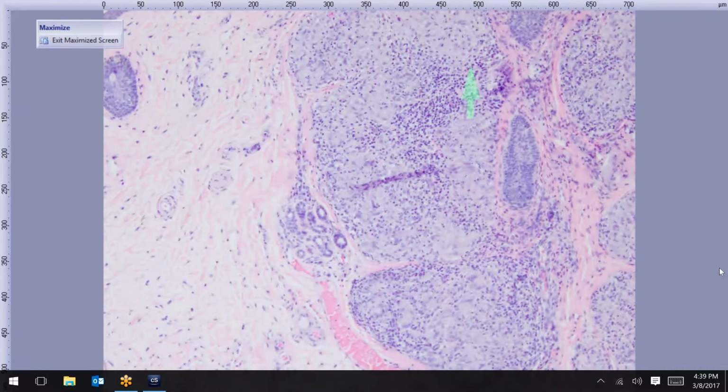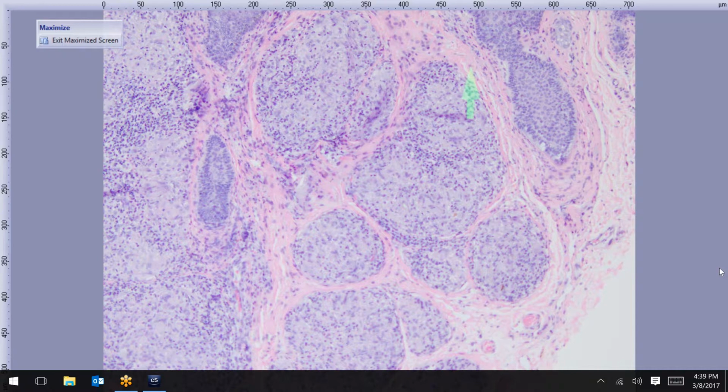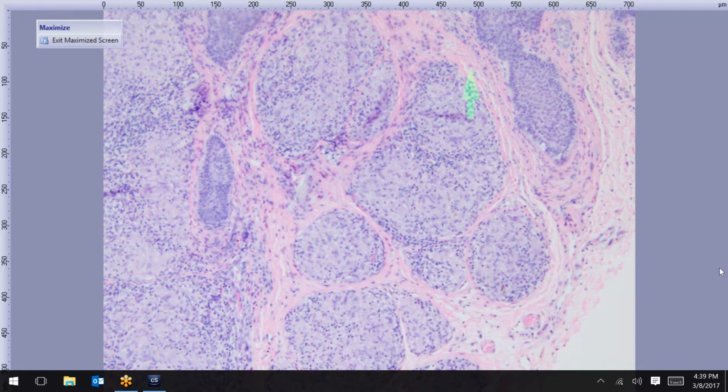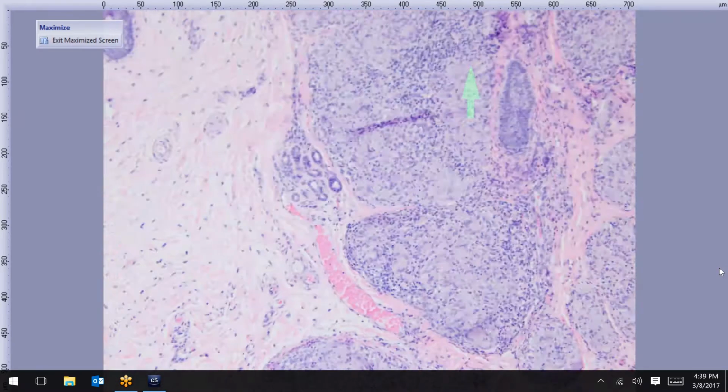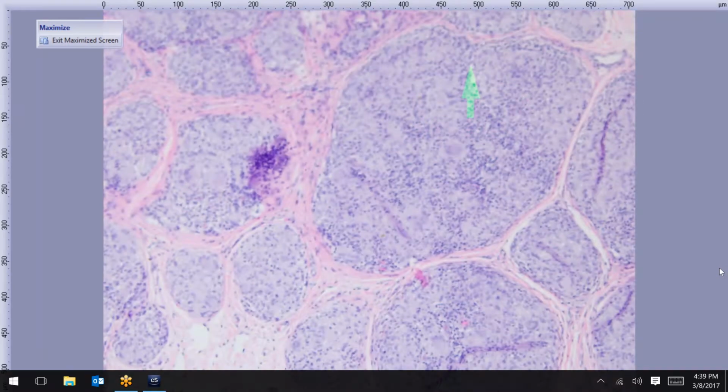If you want to stretch the differential on these things, of course, infection, foreign body reactions, depending on the clinical context, granulomatous rosacea, but this is pretty granulomatous. So, all right, cutaneous sarcoidosis.